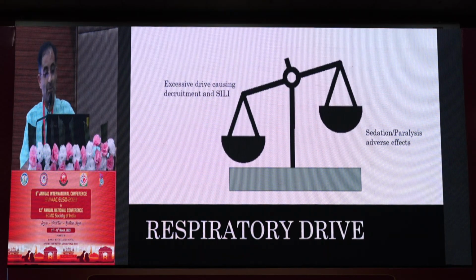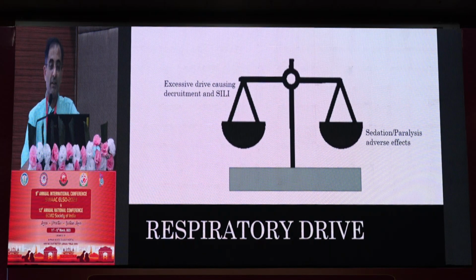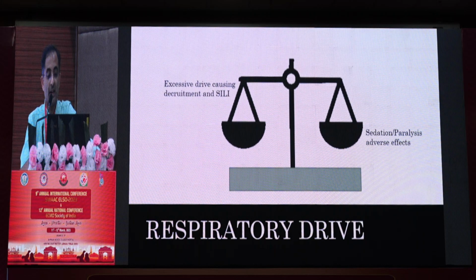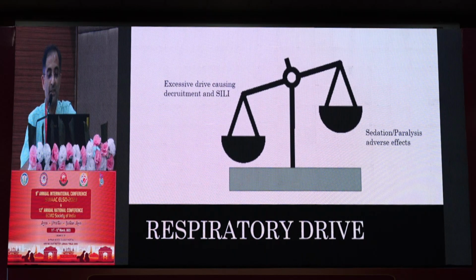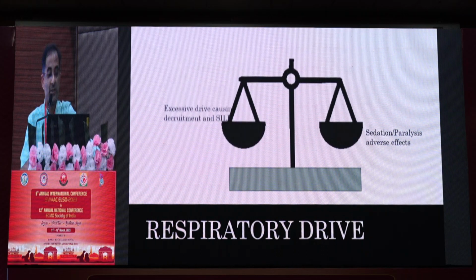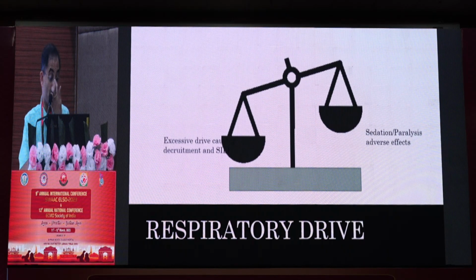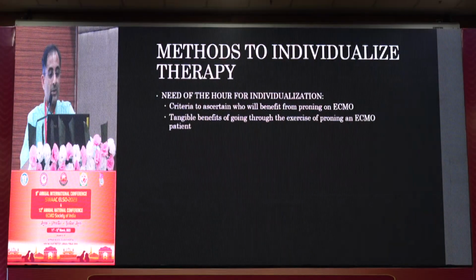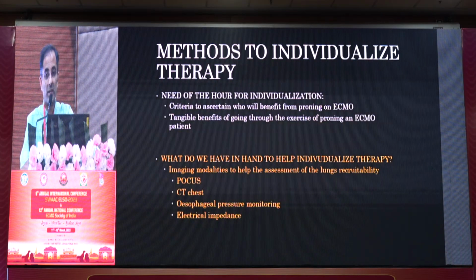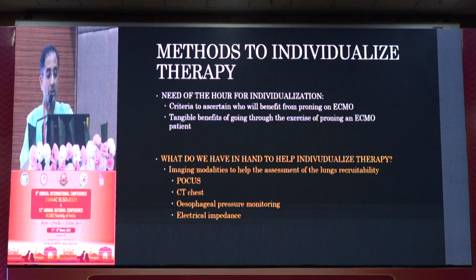Now, having a very high respiratory drive is often detrimental in the scenario of those patients. And of course, we did have talks about awake ECMO and a lot of these things. So one of the fundamental problems in keeping these patients awake is the increased respiratory drive, and hence balancing the excessive respiratory drive, which can itself cause de-recruitment and self-induced lung injury, versus the negative effects of sedation and paralysis, is something that we have to look at on a patient-to-patient basis. The methods to individualize therapy will also be based on the type of patient, the etiology, and also look at the tangible benefits of going through the exercise of proning on ECMO patients.